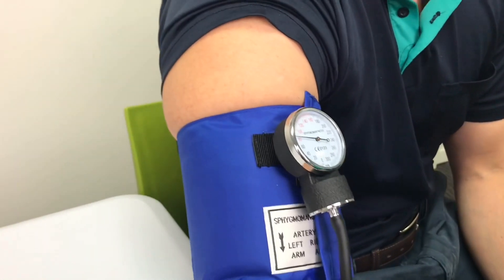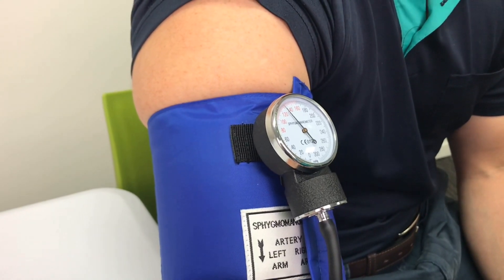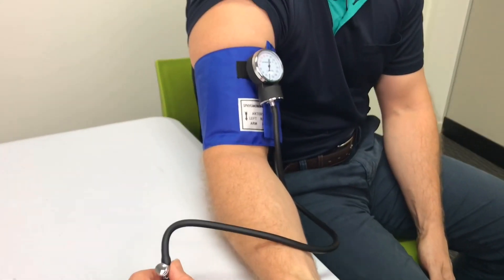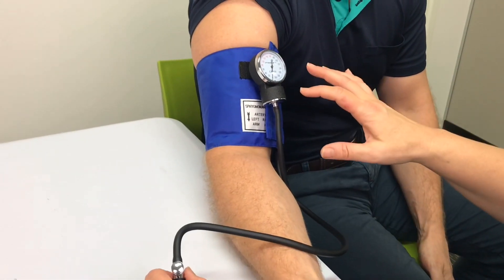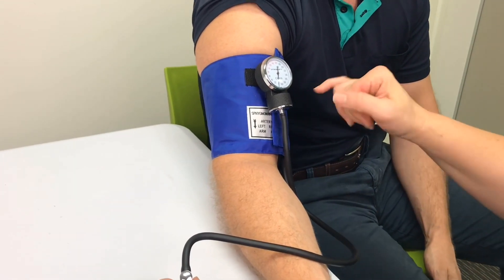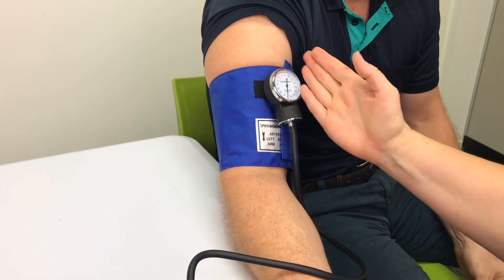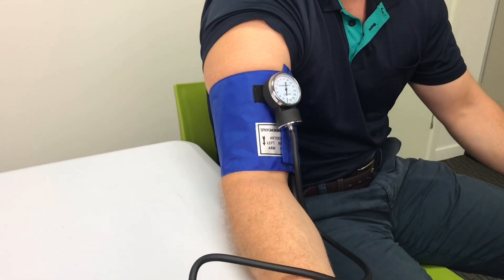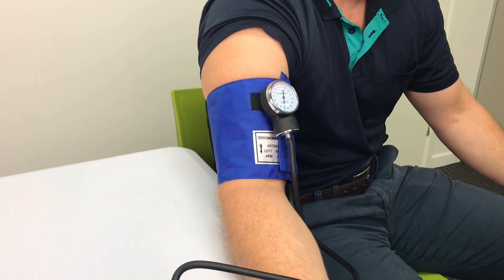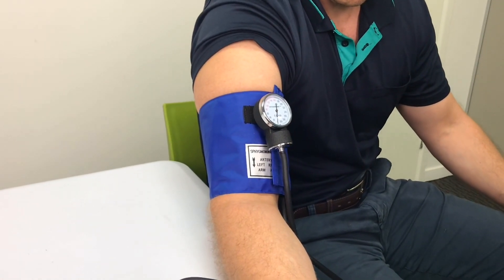First we want to palpate the radial pulse to get an indication of where the systolic reading will be. I'm feeling for the radial pulse and when it stops, that gives me an indication of where the systolic measure will be. We want to give it about 30 seconds to come back to normal. That cut out at about 130, so I need to pump up to about 20 or 30 millimeters of mercury higher than that — about 150 to 160 should be sufficient.